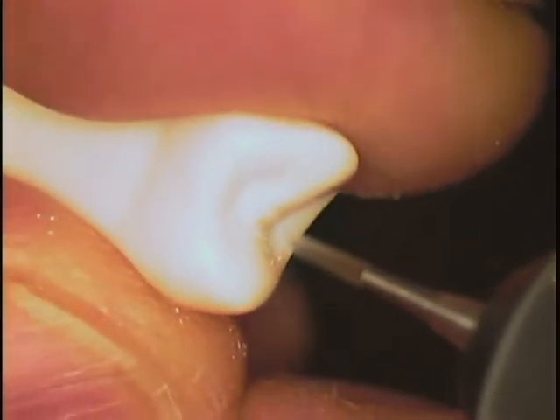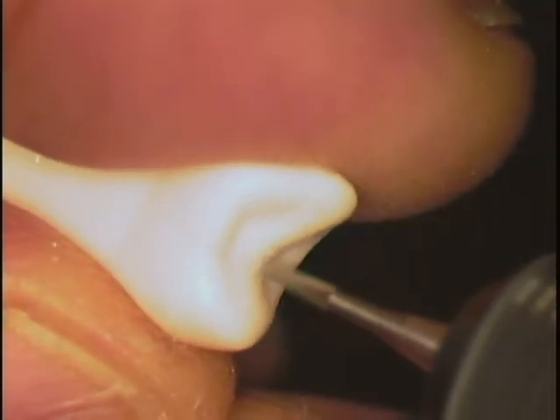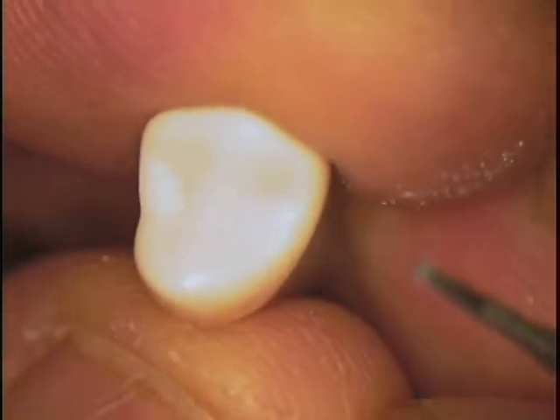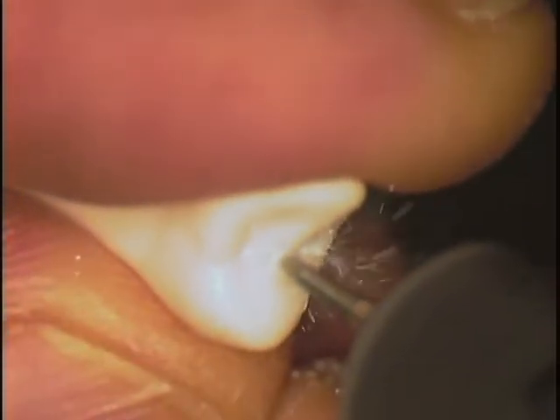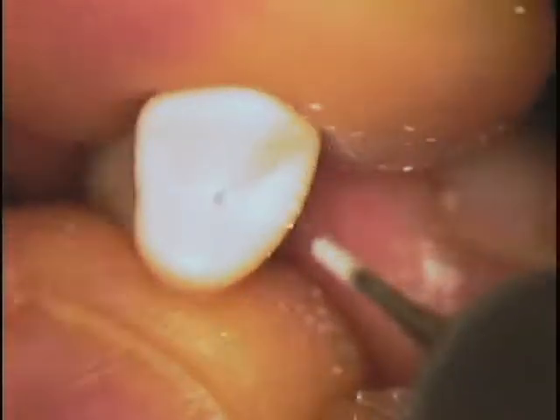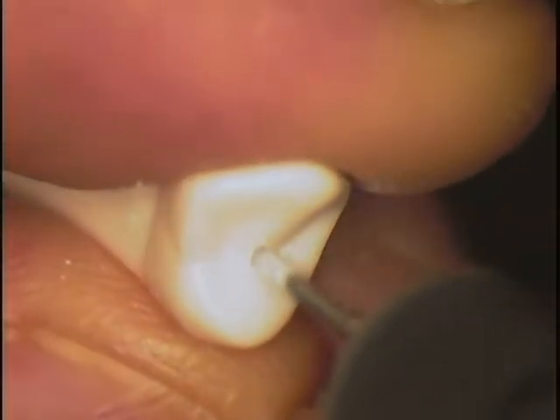All right. Now, slow power. I'm going to stay in the long axis of the tooth. This is a tapered burr. So I'm going to go ahead, and the first thing I'm going to do is look at what I've just done. Going a little bit more. I'm right about 3 millimeters now. Okay. And as soon as I see something turn red, I'll know I'll be approaching the pulp.